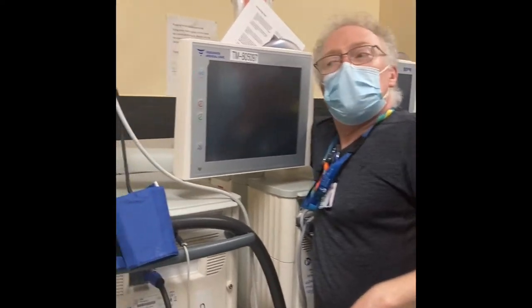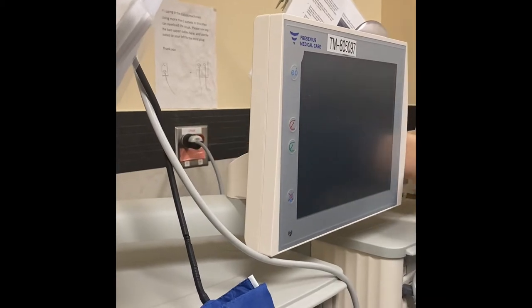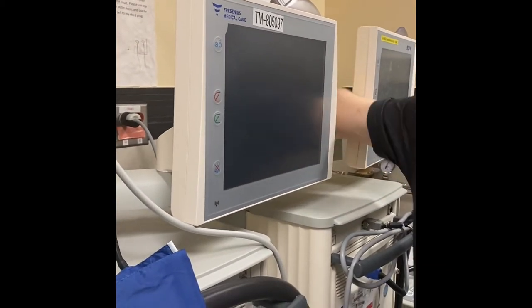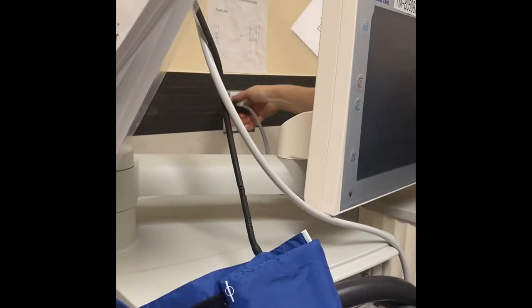First of all, unplug your machines from the power. The black cord is the Aqua Uno, and the grey cord is the dialysis machine.